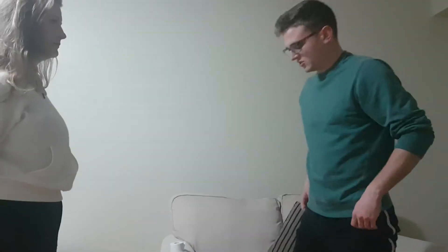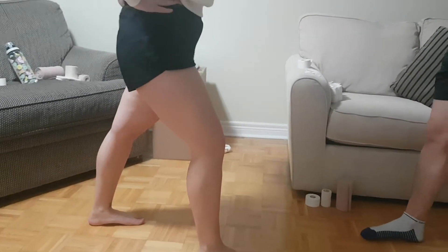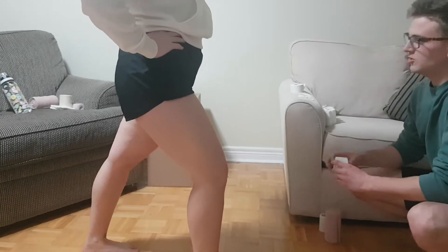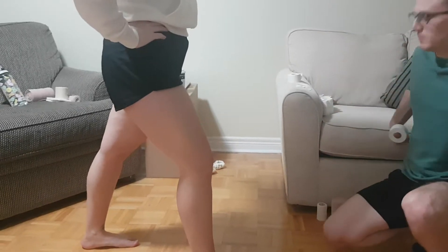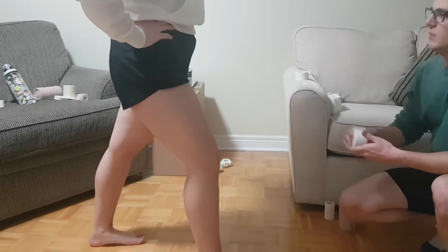So that's fine. Now I'm going to get you to stand in a lunge, kind of a tandem stance, one leg in front of the other. We're going to try to keep our hips nice and square. So the first thing I'm going to do is lay down a couple pieces of zinc tape just to help hold on this tensor. Then I'm going to wrap the tensor around your leg — it's going to come up around your hip bones, also known as your iliac crest. Am I okay to do that?